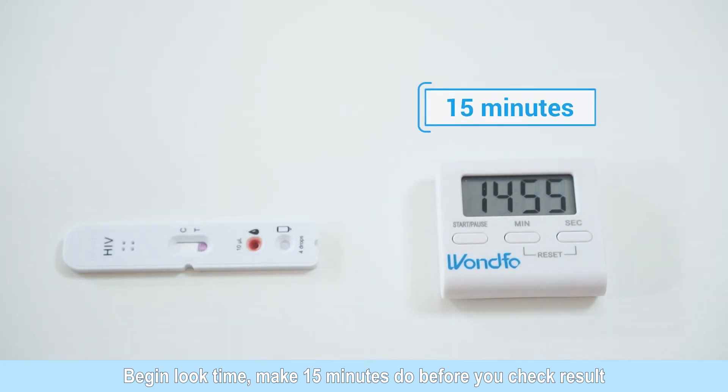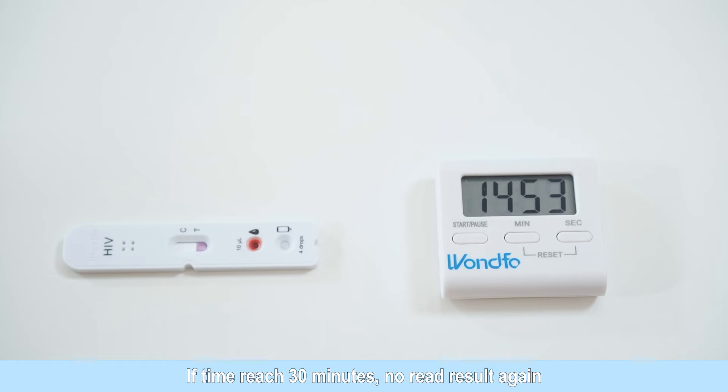Start timing and read the results after 15 minutes. Do not read the results after 30 minutes.